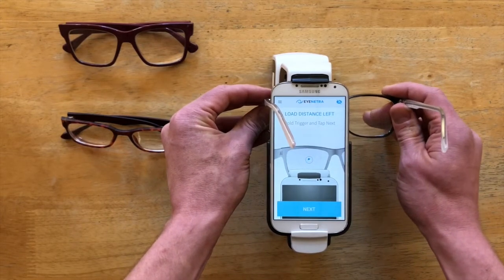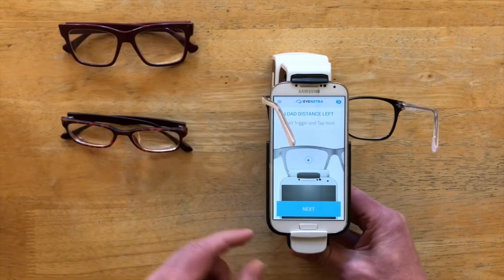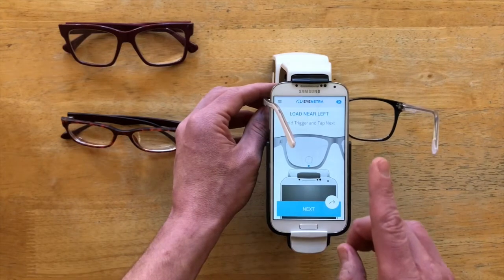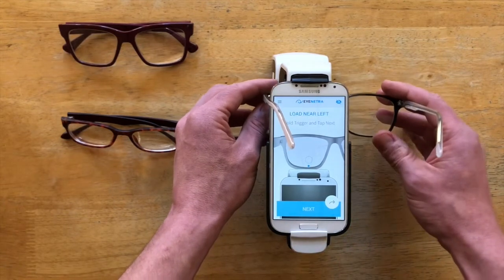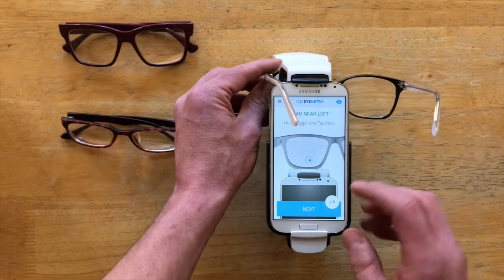I only show you that just so that you make sure you're reading the appropriate region of the lens. So okay align the dot in the circle again, squeeze the trigger, and tap next to take a reading. Now to grab the add value all I have to do is move the glasses slightly forward or away from my body. So I'll slide them up very slowly, align the dot in the circle, and tap next.